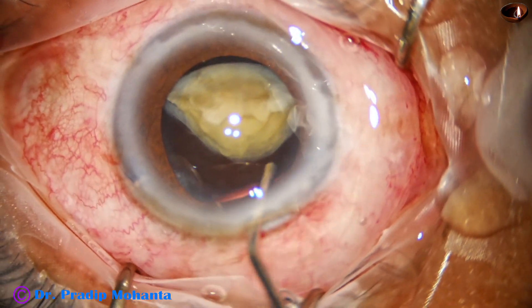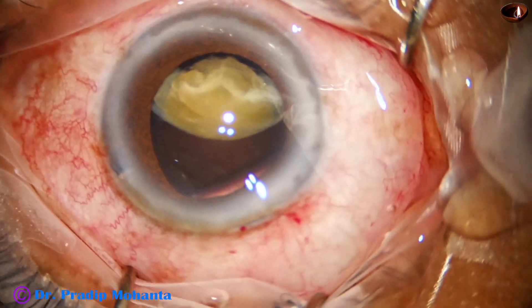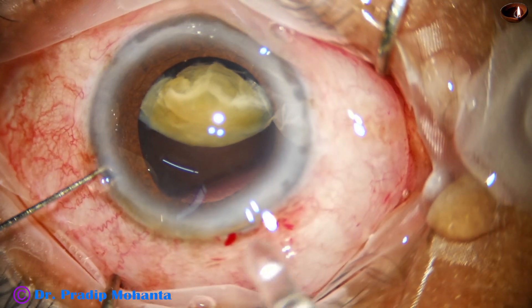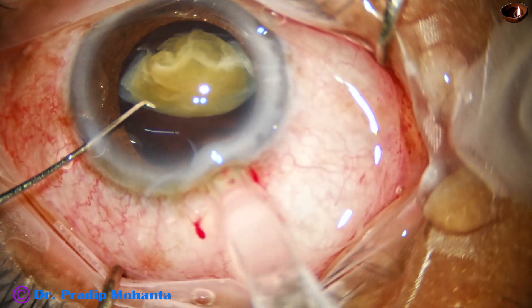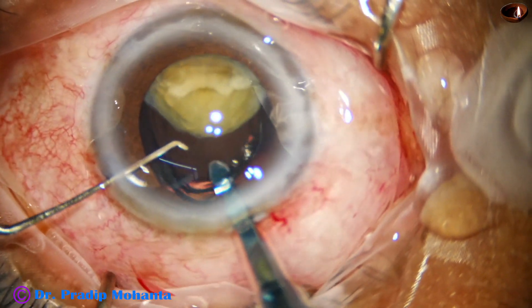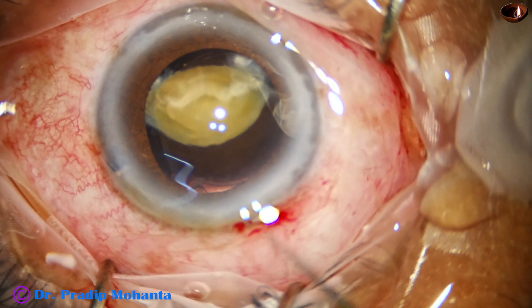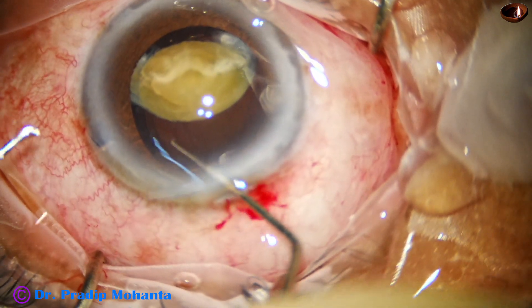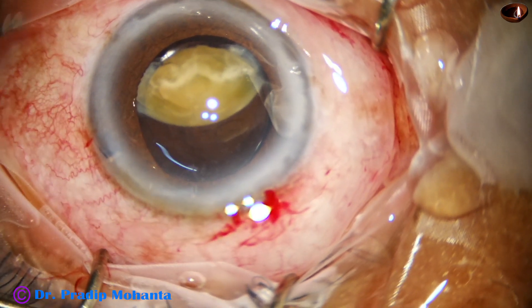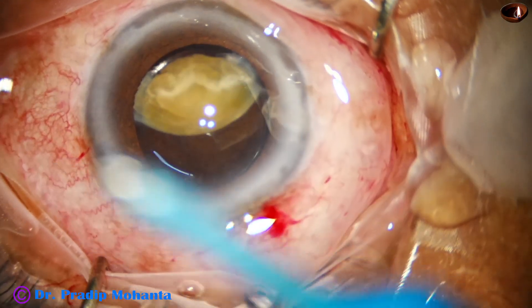For the IOL scaffold technique, viscoelastic is injected to fill the capsular bag, the intraocular lens is taken and placed into the capsular bag. The leading haptic goes in first; then the trailing haptic, with a push of the left-hand instrument at the haptic-optic junction, goes into the bag in one shot. The posterior capsule is now 100% protected.